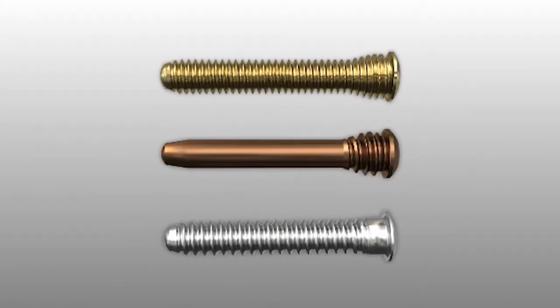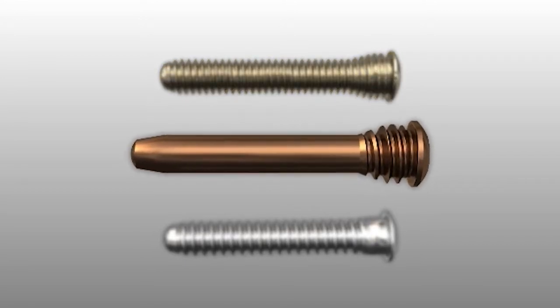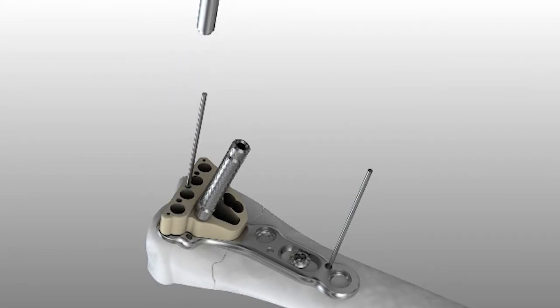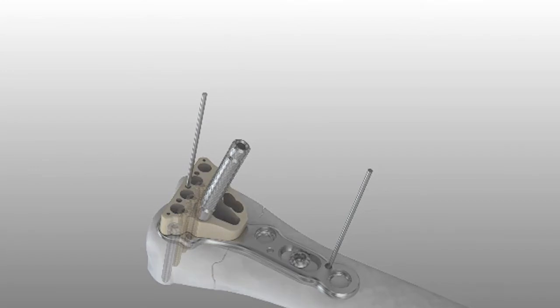There are three options of 2.3 mm screws that can be used distally. There are fully threaded locking screws, smooth locking pegs, and non-locking screws. Insert the appropriate locking or non-locking screw using the 1.5 mm driver tip, screw sleeve, and silver driver handle. It is at the discretion of the surgeon when to use the different screw options. Using the same process, drill and insert the remaining screws in the distal row.